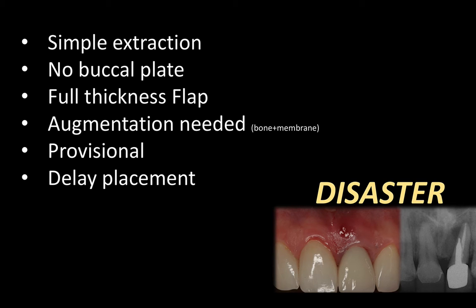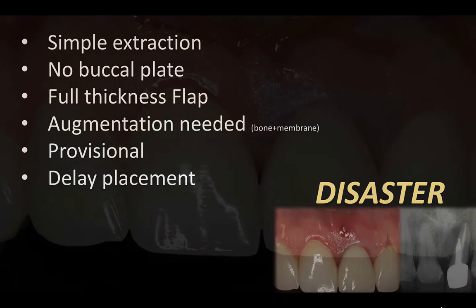It will also help you to communicate with the patient before the procedure, predicting all these things that are likely true. We'll see this in a second. So what I encourage you to do is don't jump in and treat and extract a tooth and place an implant.